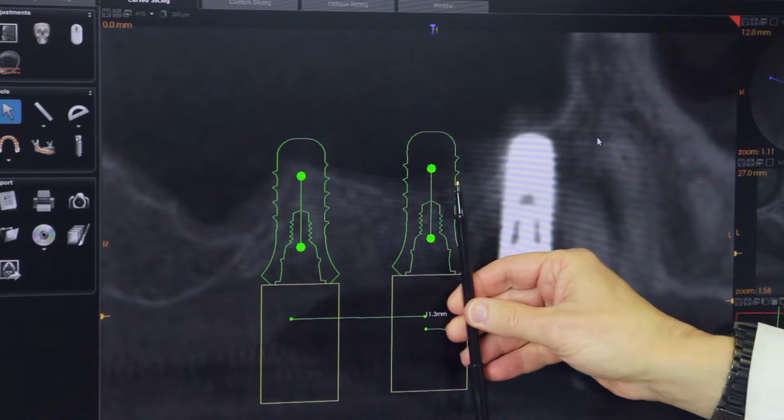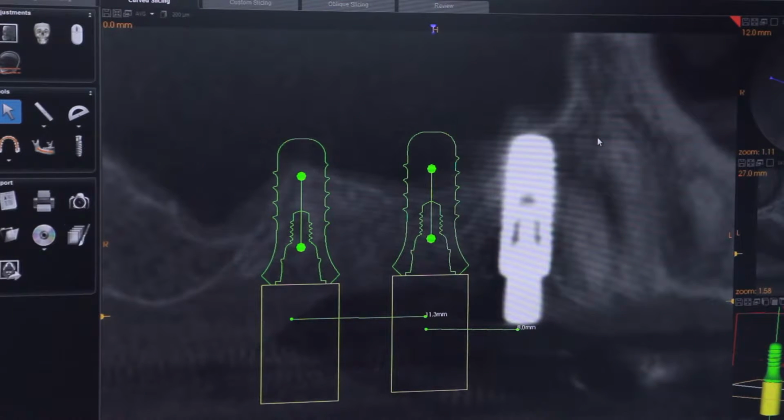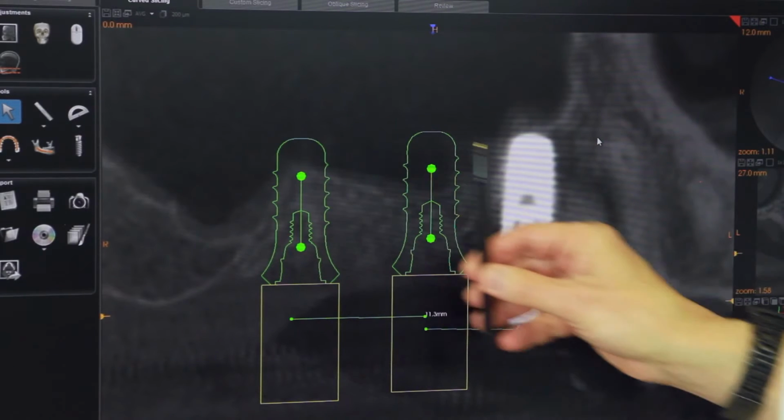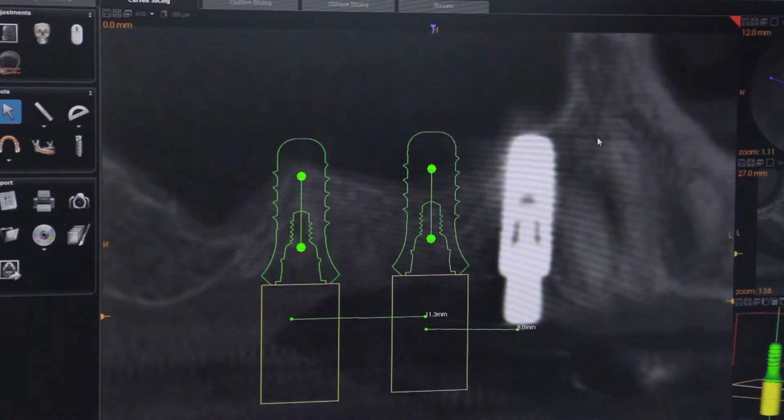If the implants are placed and puncture your sinus, you're going to end up with a communication into your sinus, which will cause you to have fluid leak from your nose when you drink fluids, and you can end up with a massive sinus infection which would require several days or several weeks of treatment as well as surgery to correct the problem. So it's imperative that you have a 3-dimensional scan of the upper jawbone, just like with the lower jawbone, to avoid these critical structures.